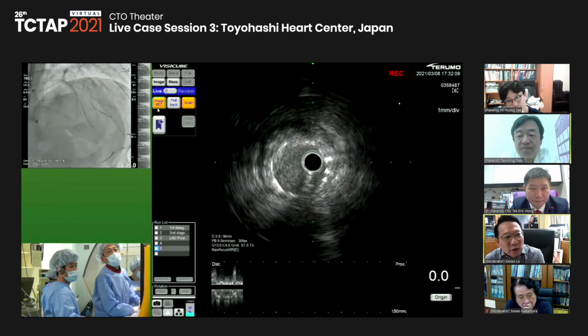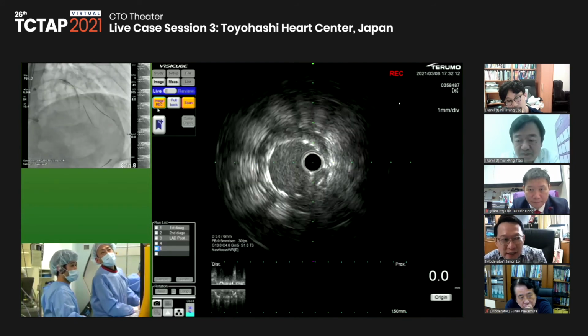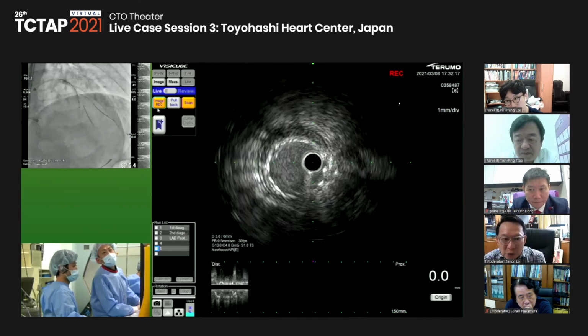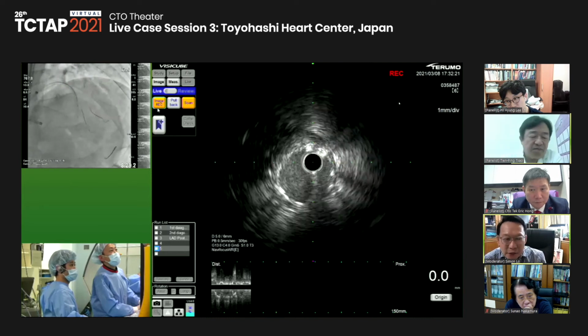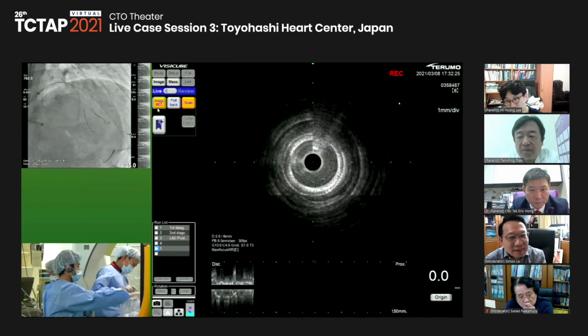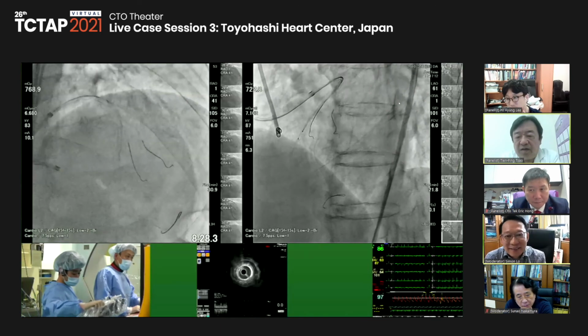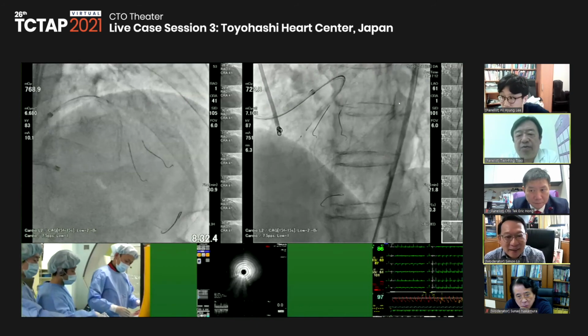But in this case, it looks like from the IVUS, the segment of the stent where the second diagonal comes out, the area near the second diagonal was also under inflated. So they should post dilate the segment proximal to the second diagonal with a bigger balloon.